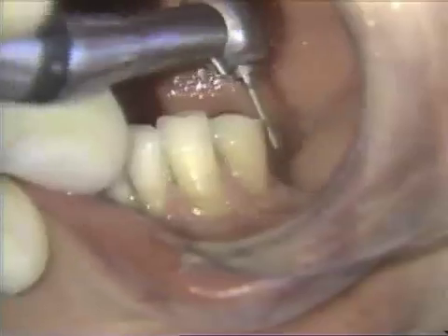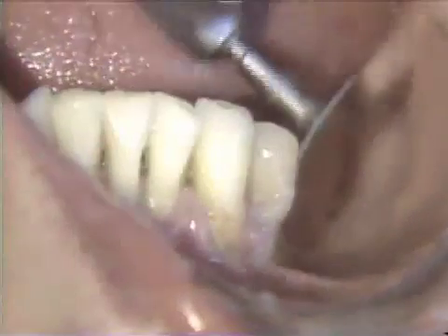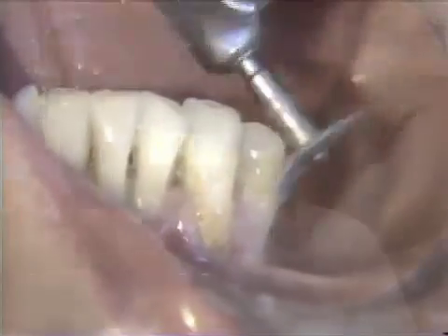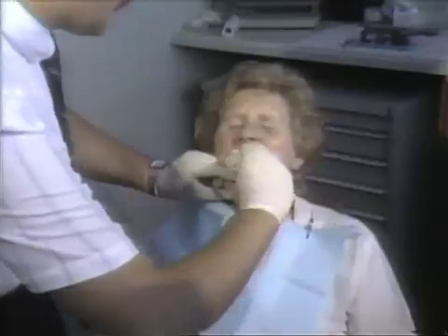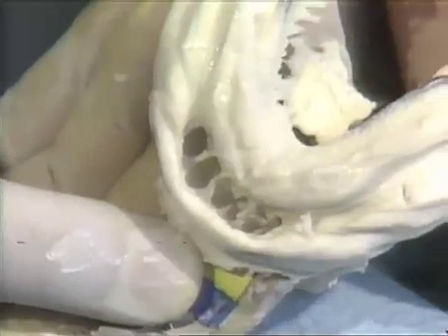This is accomplished with a diamond. A disc is then used to polish the distal buccal. An alginate impression is taken to verify the contour and the model is surveyed. If further contouring is necessary, it is done prior to the taking of the master cast impression.